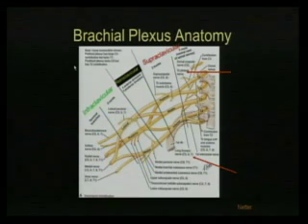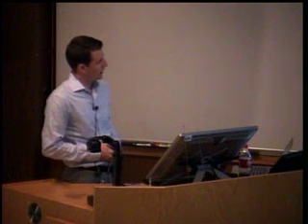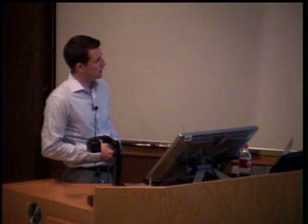So I start at the cord, and that image isn't here, but then as I come lateral, you find the anterior scalene, middle scalene muscle, the first rib, and the subclavian artery. Once you find those parts, you know for a fact, if it's a sagittal image that's true to midline, that you'll be in the supraclavicular region. And you'll know that the roots and trunks lie vertically in between the anterior and middle scalene muscles and also the subclavian artery and the first rib.